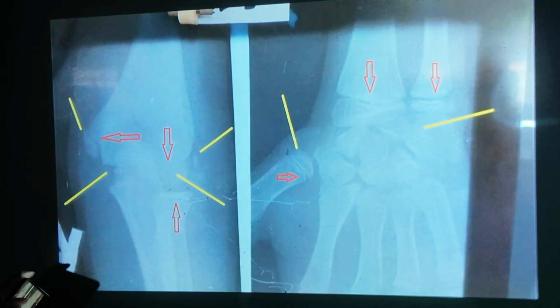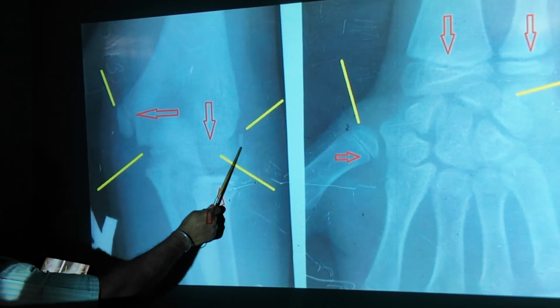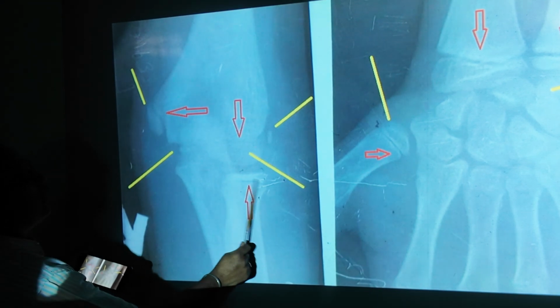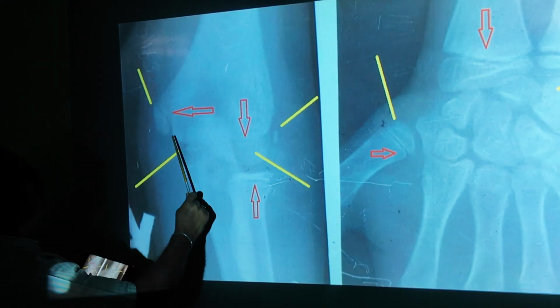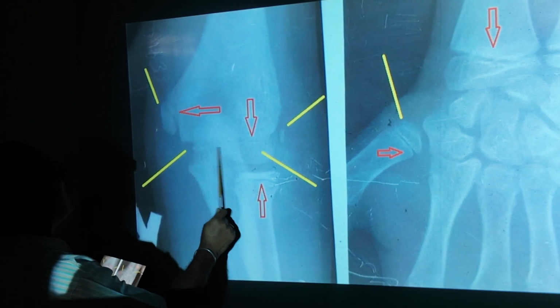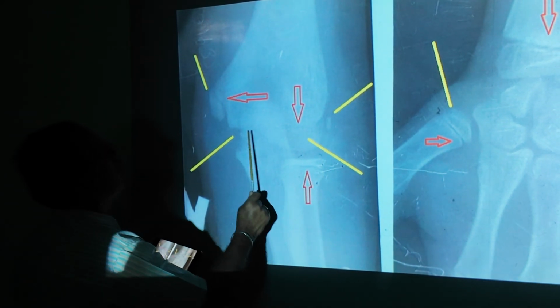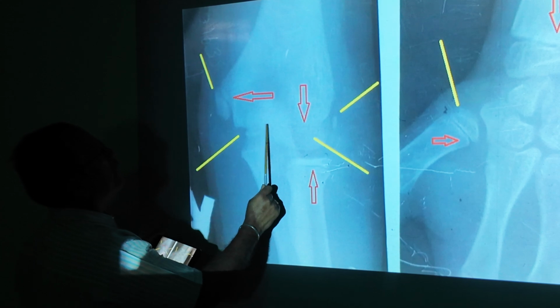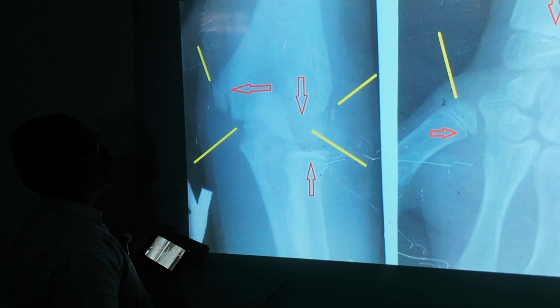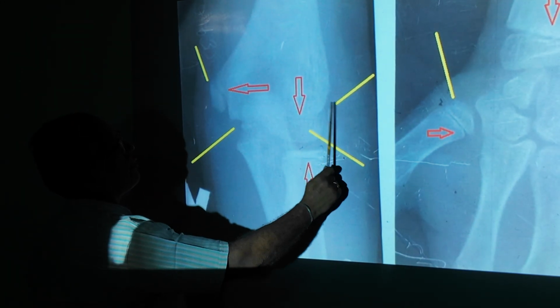In this X-ray, a small tiny dot is lateral epicondyle. This is medial epicondyle, upper end of radius, upper end of ulna, capitulum is formed, trochlea also formed. Lateral epicondyle forms by 11 years. Trochlea appears by 9 years. Medial epicondyle appears by 5 to 6 years. It is about to appear, not completely formed, 11 years.